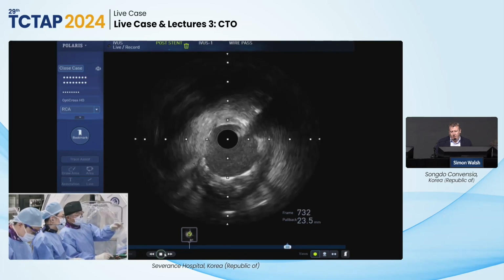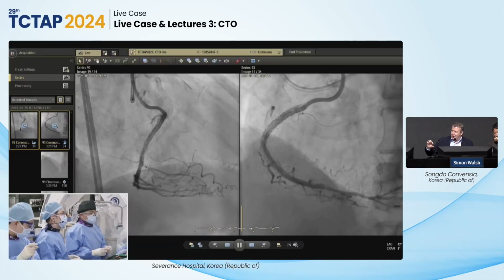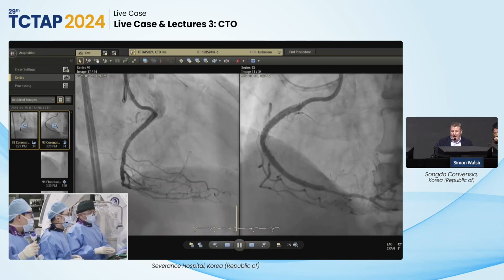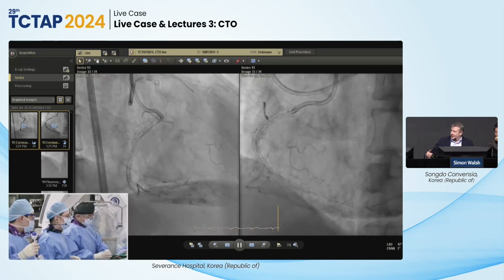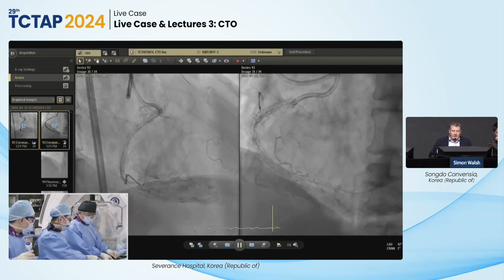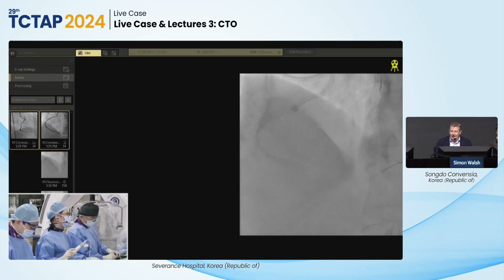And the other question here is, what's the true plaque burden at the distal edge? I think it's just landed on a bit of atheroma, but it's not terrible. And again, the key thing is that we measure these things and actually make objective decisions rather than just throwing an eyeball at it. It's got to be better than that.